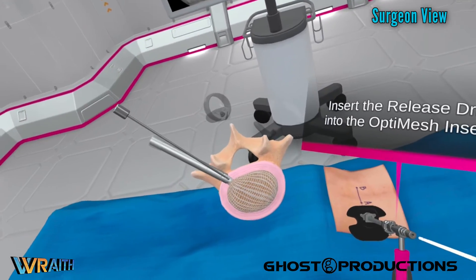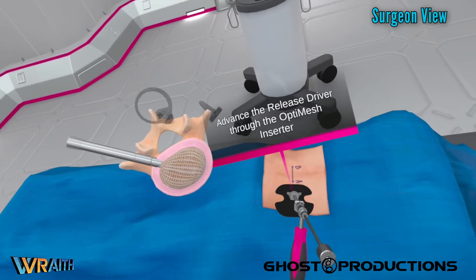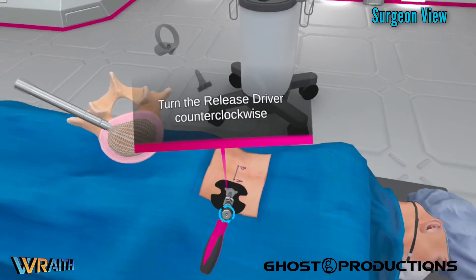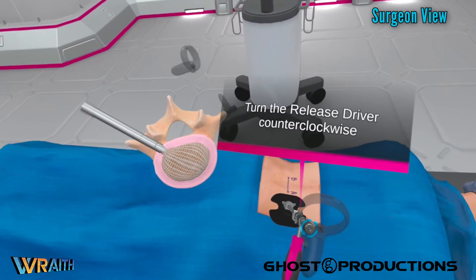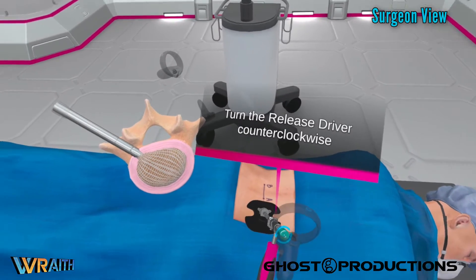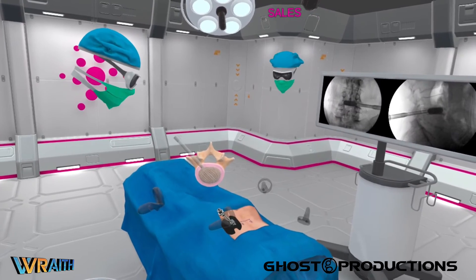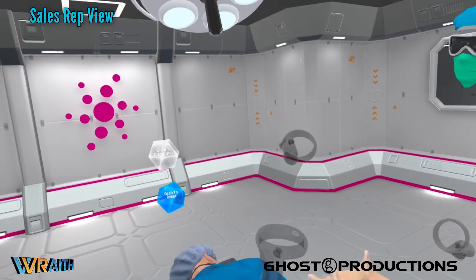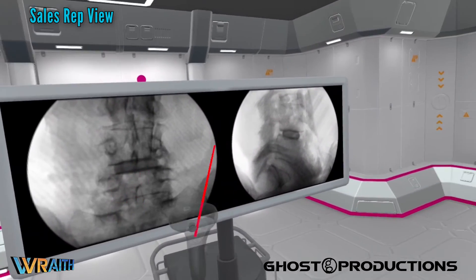Drive down here and it's going to disconnect the collet that is holding the mesh to the inserter and allow you to remove the inserter from the space. Now we just remove the access portal, and what we're left with is a fully implanted OptiMesh. We can get a view with fluoro of what it looks like.